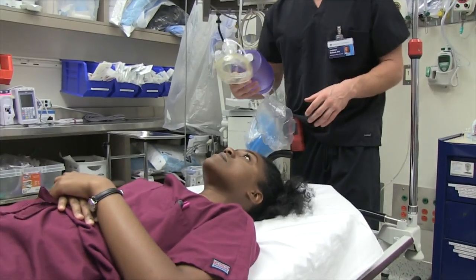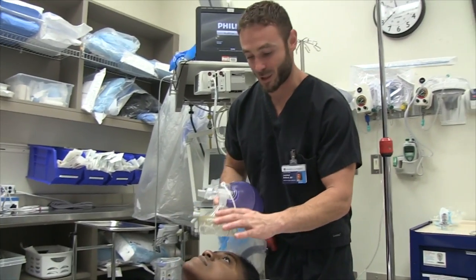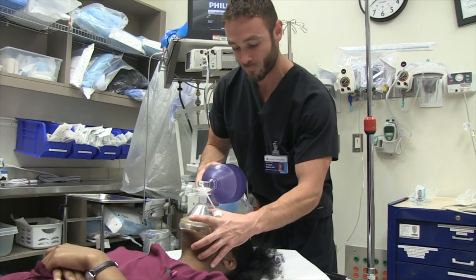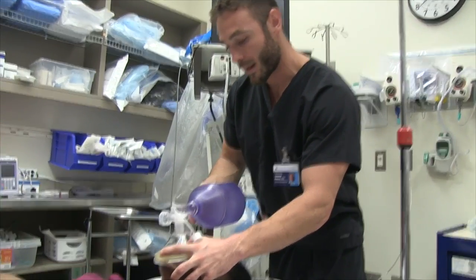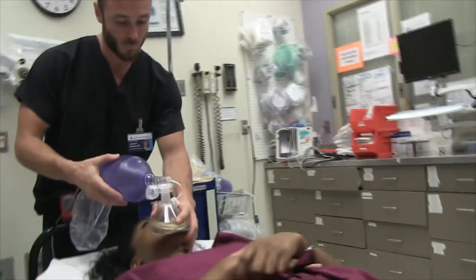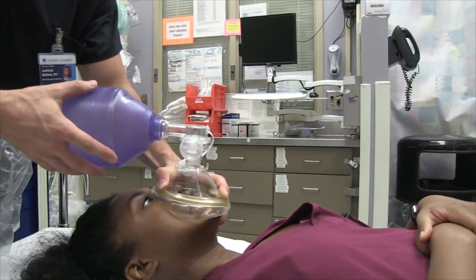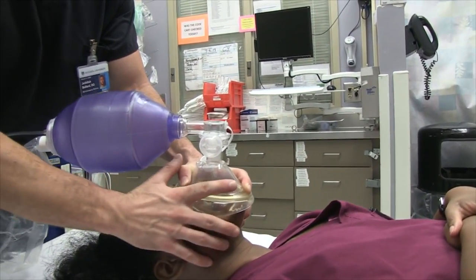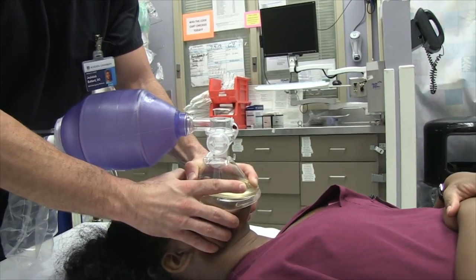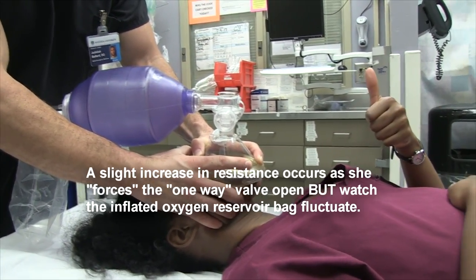So the question is, can a patient breathe through a bag valve mask? Here to test it out is Valen, our stellar med student. We're going to create a good seal here. Nice C, and it's enough. You're not going to bag for her; we're just going to have her breathe in and out normally. If I'm not bagging, I'm just going to go ahead and do a two-hand. Make sure we get a really good seal. Looks like she's having no problem whatsoever. We got a thumbs up.